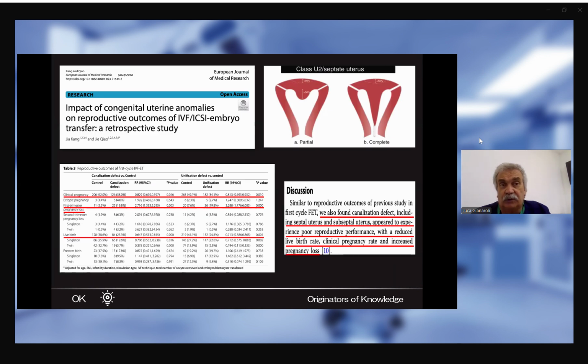It's true that most of the time we don't need hysteroscopy to detect congenital uterine anomalies, but, as was clearly said before, since each septum or subseptum is completely different, having the opportunity to check by forceps or simple instruments during diagnostic hysteroscopy could also play an important role in deciding whether or not to remove this abnormality.